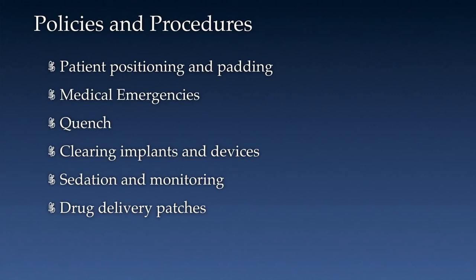Do you have policies and procedures that address medical emergencies and how to emergently remove a patient from the MRI environment? Quench policies and procedures, when to quench, who's allowed to determine to quench. Do you even know where the quench button is? Are your quench pipes, the vent system, is it adequate? Has it been checked?